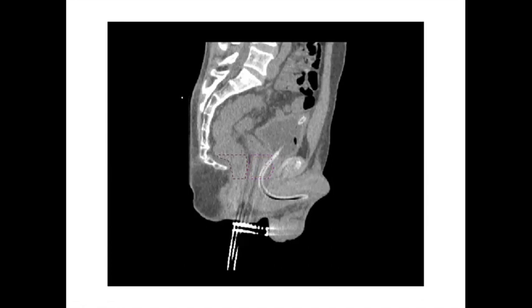So splitting the patient right and left, this is an image straight through their centre, because you can see the spine at the back here. And you can see the rectum, which is marked at the back, and the bowel that goes up behind. And again, you can see all the tubes coming in through the skin into the prostate gland. You can also see quite nicely on this image the catheter, or at least some of it. So the catheter does this U-bend here, where it's coming in from the penis. It's going through the urethra, round up through the prostate and into the bladder.